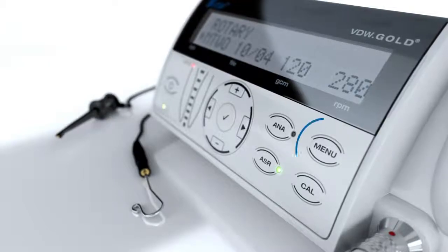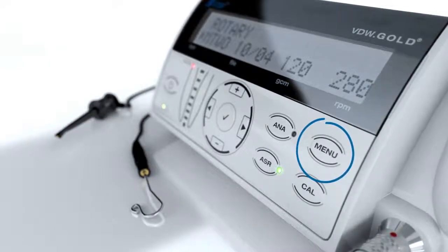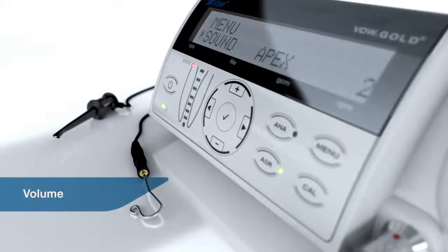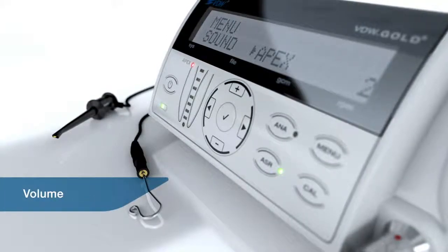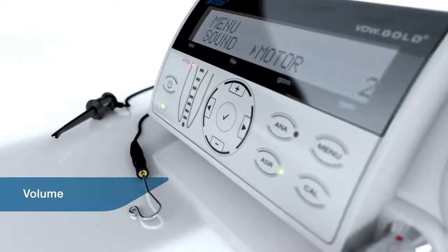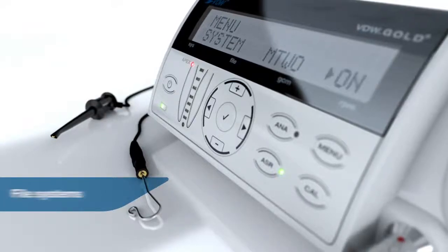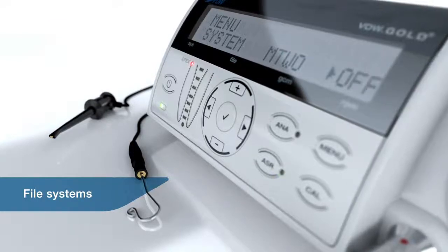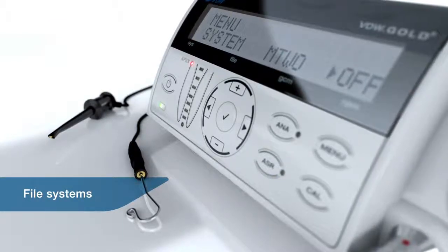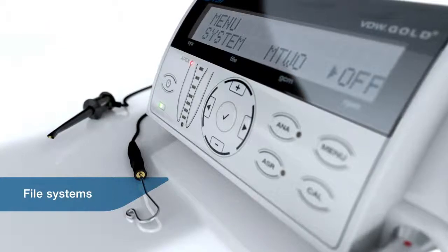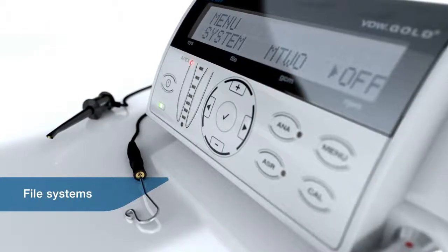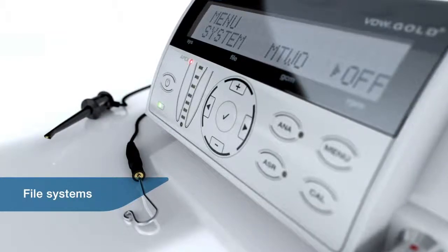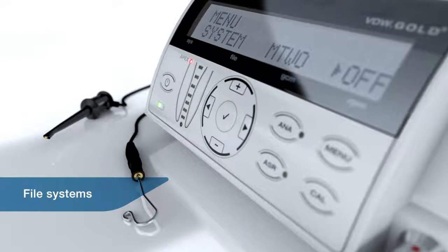By pressing the menu key, you can change settings. Volume for the motor and apex locator warning signals can be set individually. You can show and hide file systems according to personal preferences. To do this, select system with the help of the plus and minus keys. Use the right arrow key to move to the right, and then select the desired file system by using the plus or minus key.